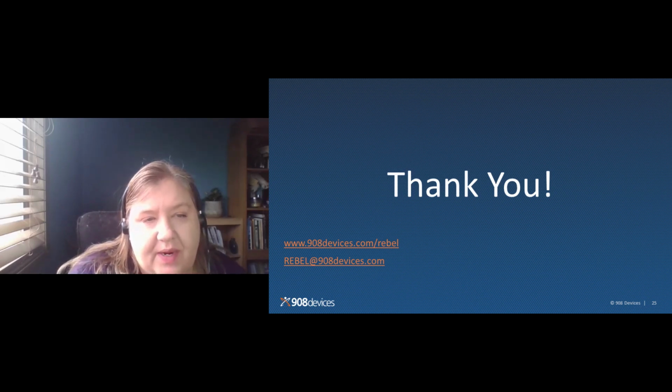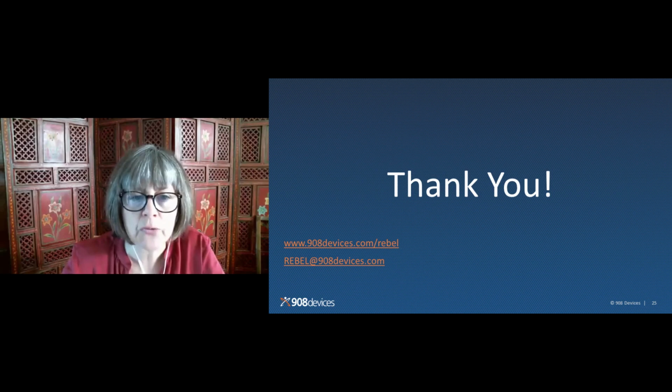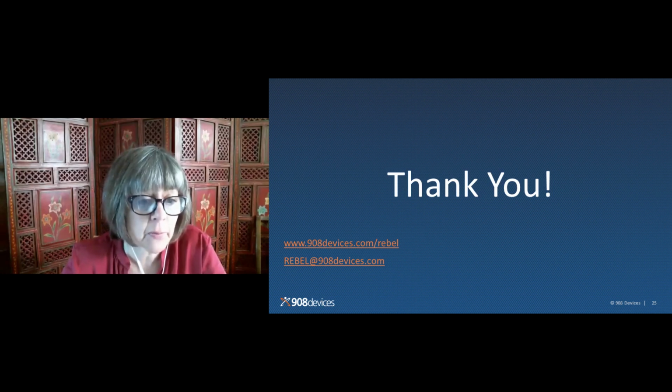So how often do you recommend measuring amino acids in the CAR-T process, Graziella? Yeah, thank you for the question. So in the work at Emory University in Dr. Dreden's lab, at the moment they measure amino acids just at the end. But of course, the more measurements you do throughout the process, so you can see the evolution of the amino acid consumption, the more information you will get and the more input you can have on understanding if some amino acids are being depleted or some overproduced. So the more information throughout the process you can have, the better.